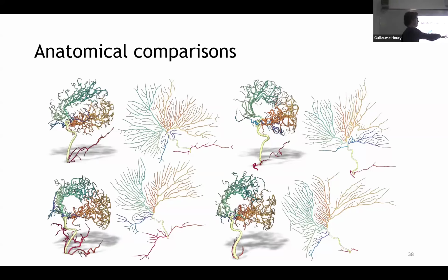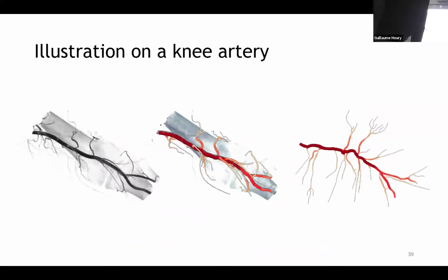Since we aligned the branches in a globally meaningful way, we have these nice clusters represented here that are consistent from one view to the other. So we may use this kind of visualization to compare different brains as well, to explore the structure of the brains of different persons in an easier and more visual way.